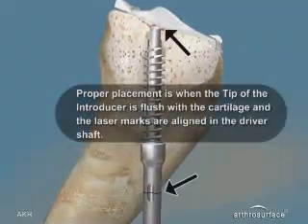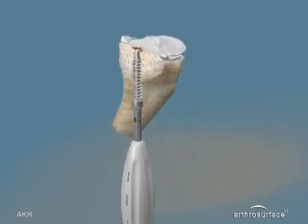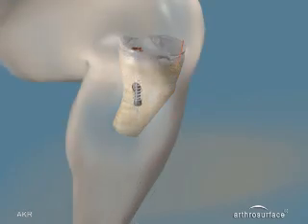Proper placement of the blade stop is when the tip of the introducer is flush with the cartilage on the plateau and the laser marks are aligned in the driver shaft. Remove the driver and the introducer, leaving the blade stop in place.